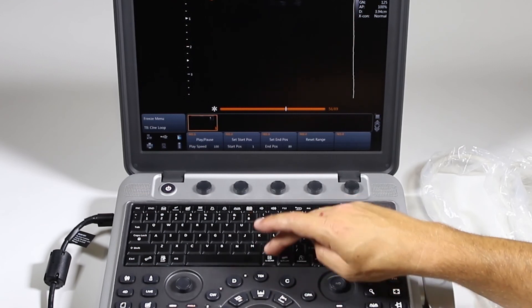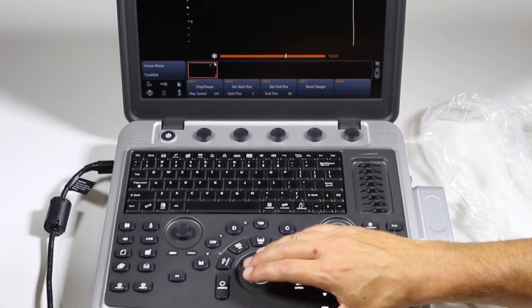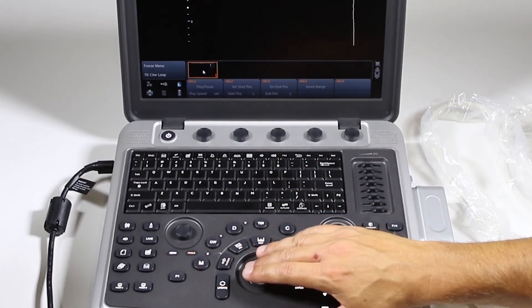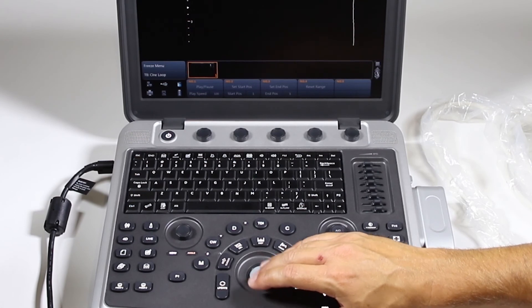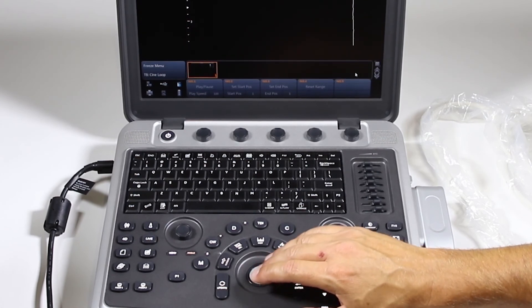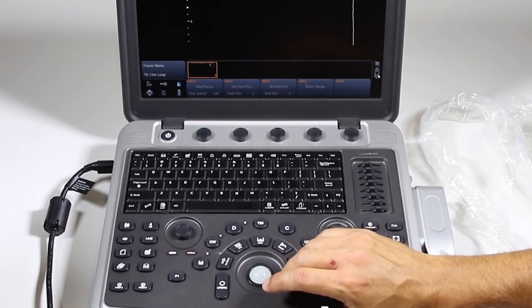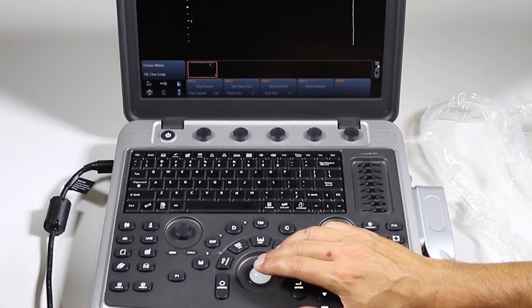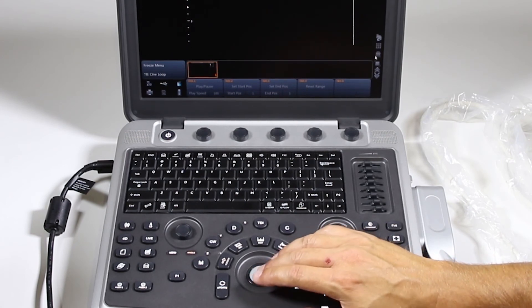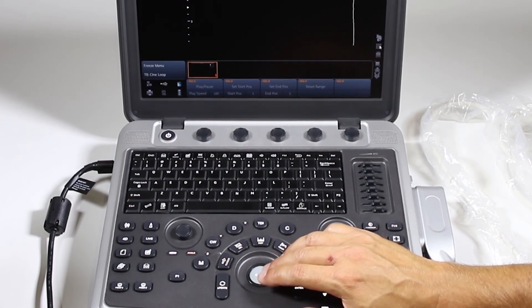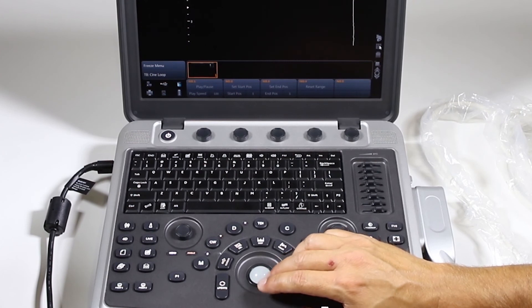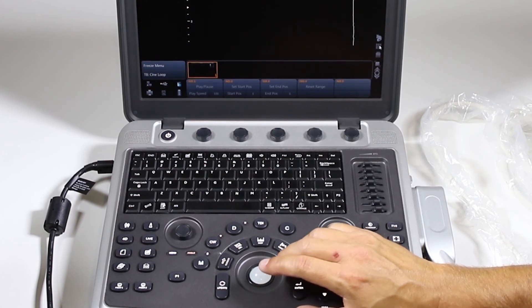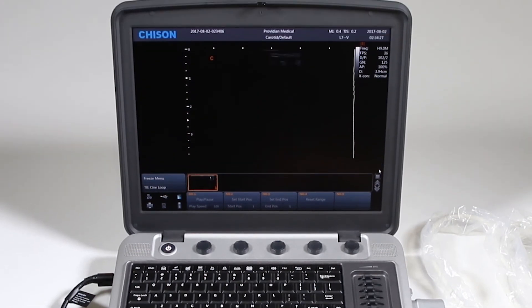But if there are multiple pages of thumbnails for this exam, I can click here and go forward and back. This will also let me save it to a disk, USB. I can go to the screen that will show me mini, or I can just go ahead and delete that.